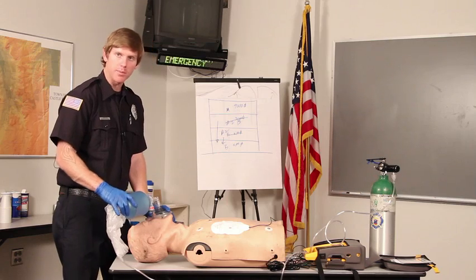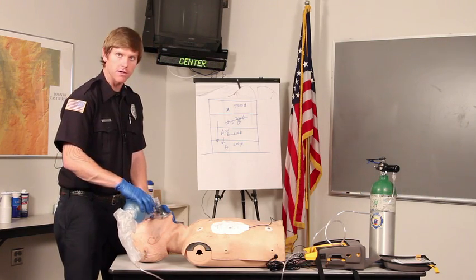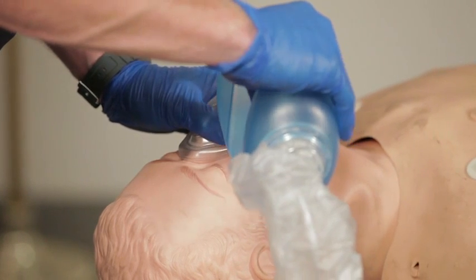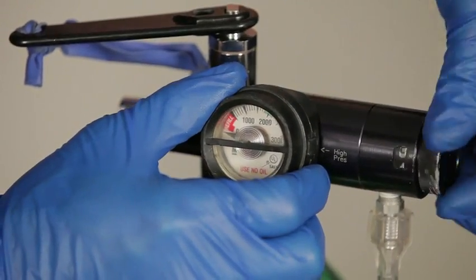We want to create the proper seal, and we want to ventilate our patient effectively, looking for good chest rise and fall. We also want to be oxygenating our patient, so you're going to want to hook up oxygen to your bag valve mask.